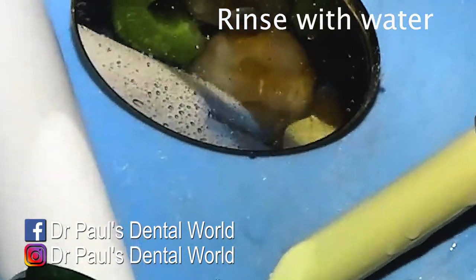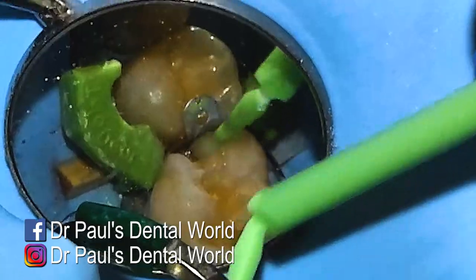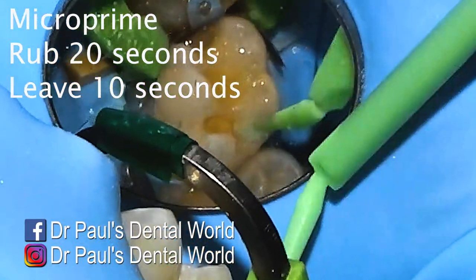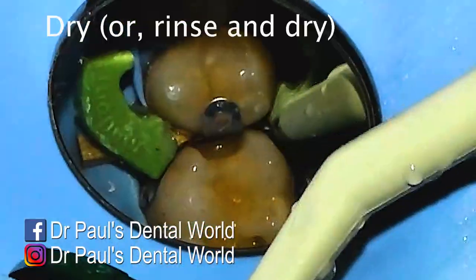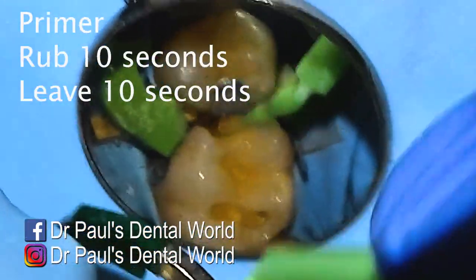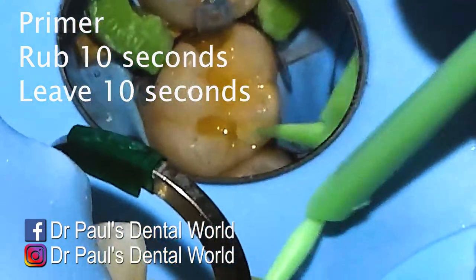Then you're going to dry it, but don't over-dry it to the point where the dentine becomes frosted, because it can lead to sensitivity. Now we're going to use microprime — you basically rub it into the dentine for about 20 seconds, then leave it for 10, and then air-dry it but don't over-dry it again. Microprime helps decrease sensitivity.